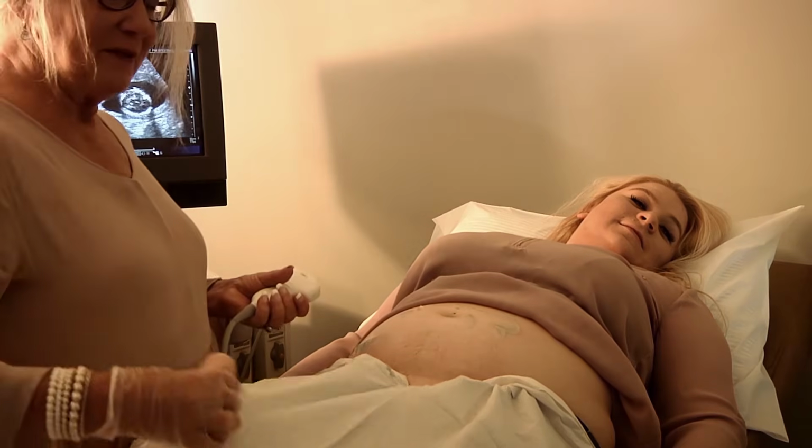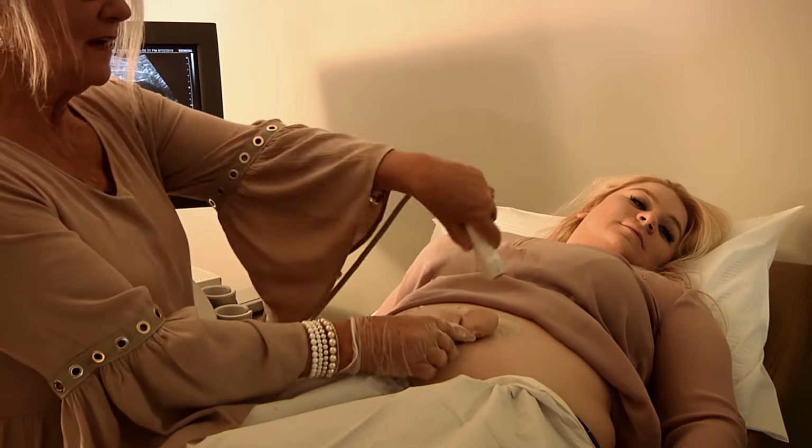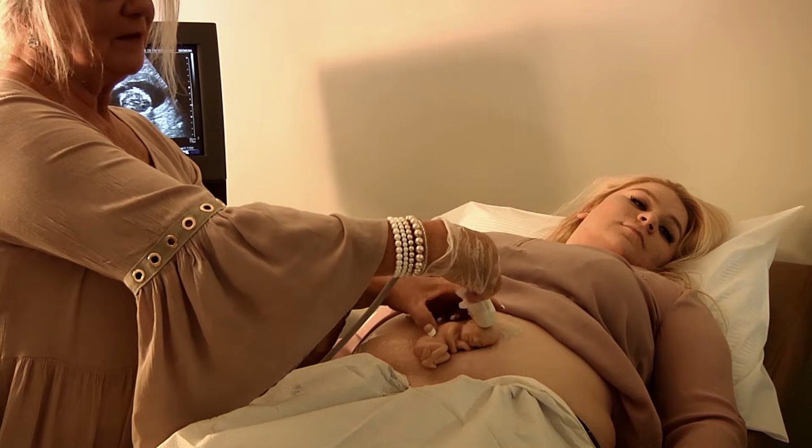So remember, baby hasn't moved yet. This is the road of our baby. No traveling outside the road. Okay? We found the sagittal plane. We've gone 90 degrees. And we went up and got the head.